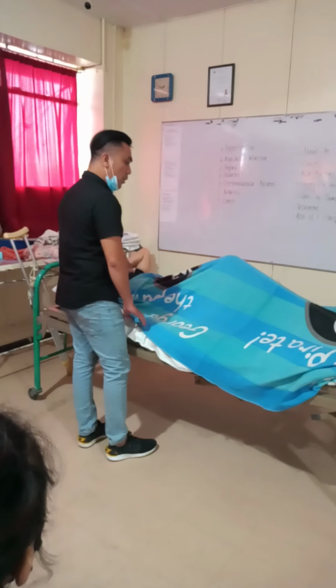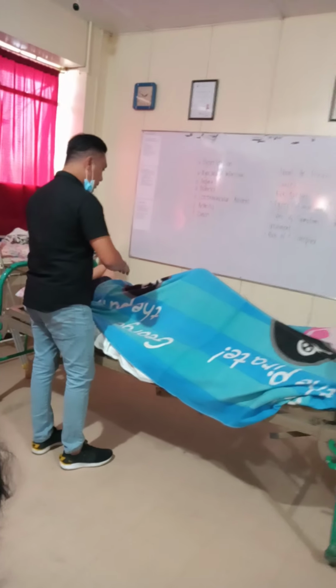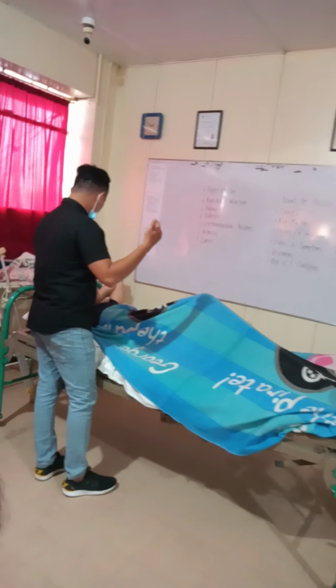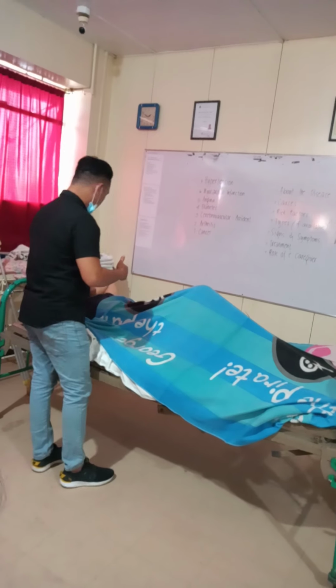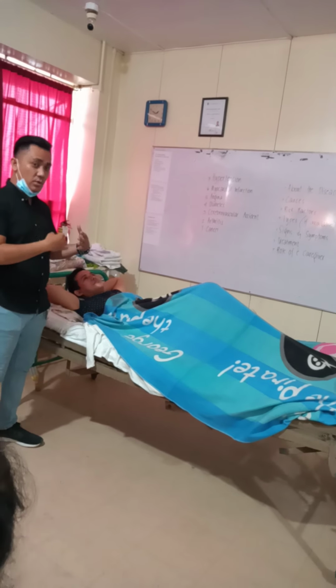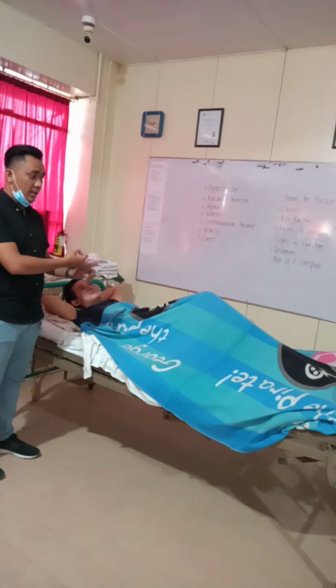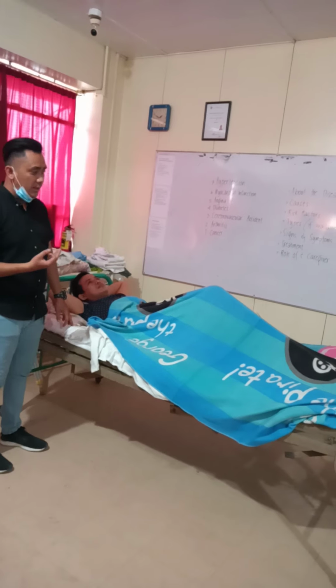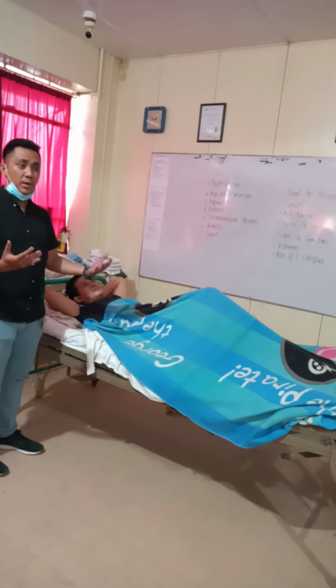I understand that you want to transfer to the wheelchair and go out. So, is it okay to assist you? Okay. So, after introducing yourself, explain the procedures, why you are here, and then ask the patient if it's okay for you to assist them. Then, after that one, provide privacy.